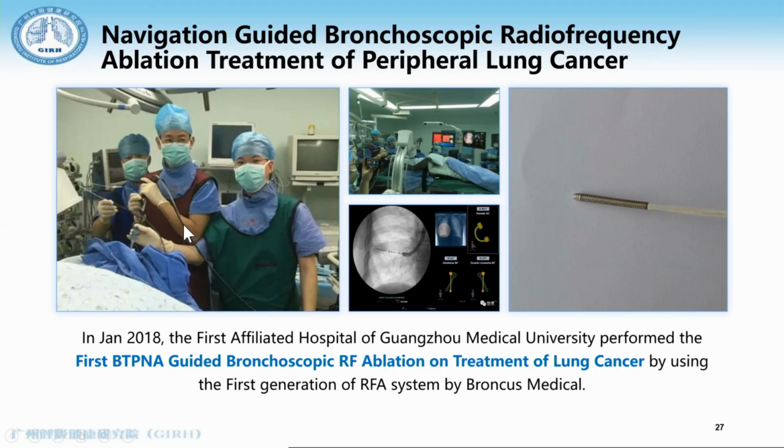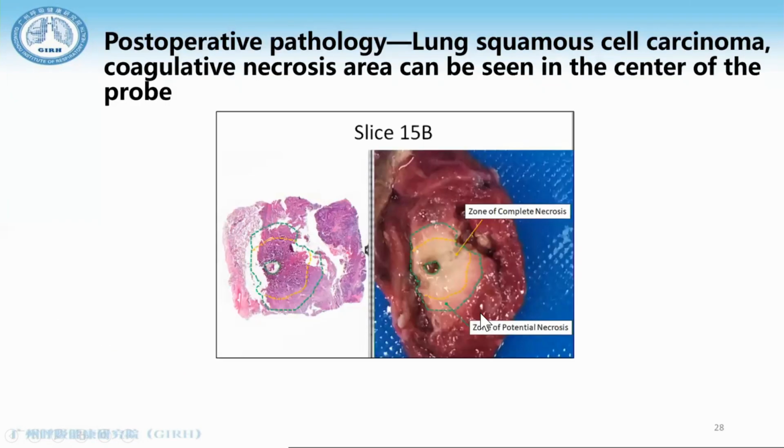First, with the assistance of BTPNA and CT images, we used regular radio frequency from ERBE. We treated 3 cases, and the patients then received surgery.